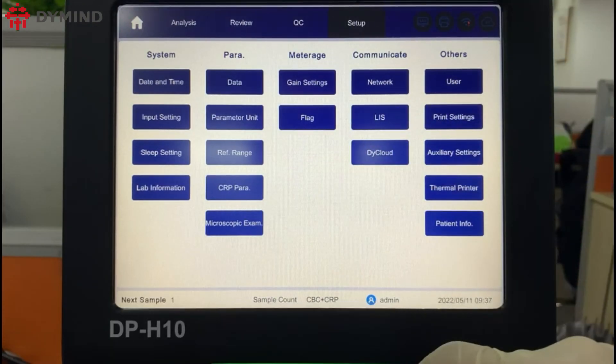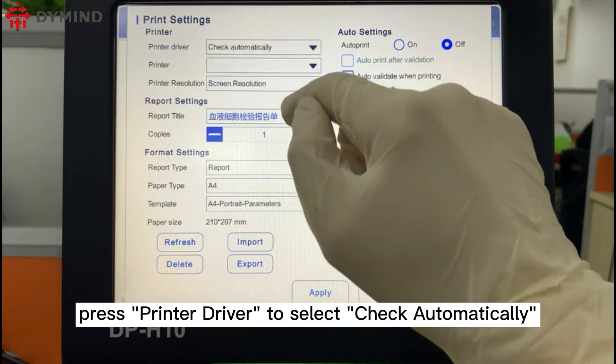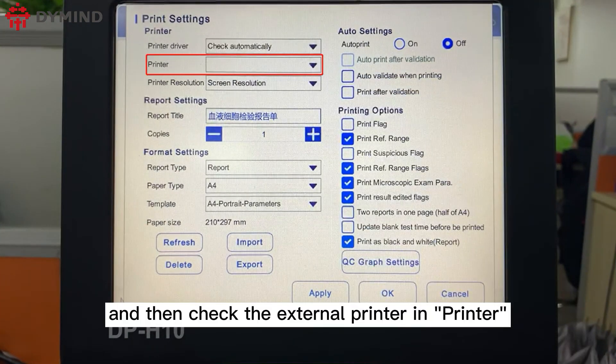Click Print Setting, then press Printer Driver to select Check Automatically, and then check the external printer in Printer Setup after completing the print setting.